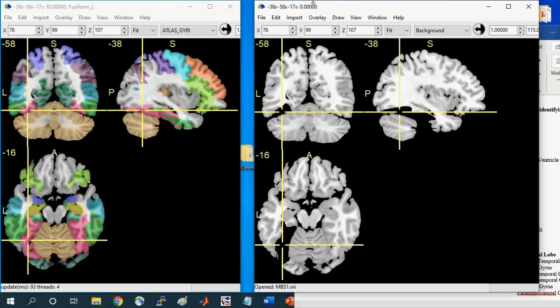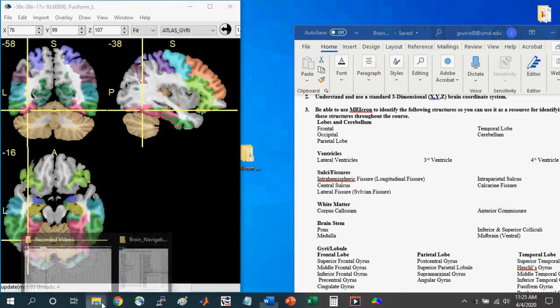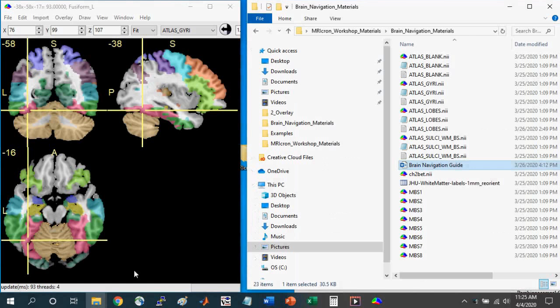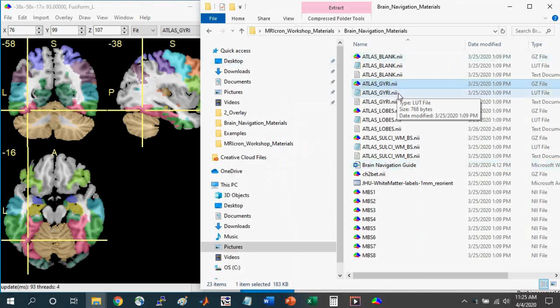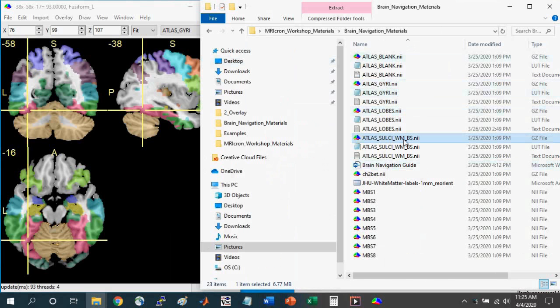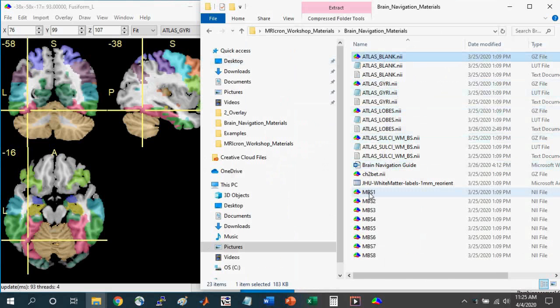Okay, so I've gone over using the different atlases that I've included with the materials, including the gyri lobes, the Sulci WM BS atlas. I've included the blank atlas that you can use to quiz yourself or to be quizzed as part of a course. And also the missing brain structure files where you can, again, quiz yourself or follow through on assignments as part of a course.